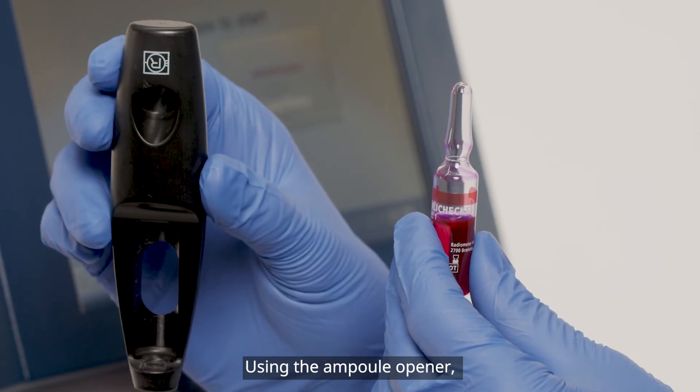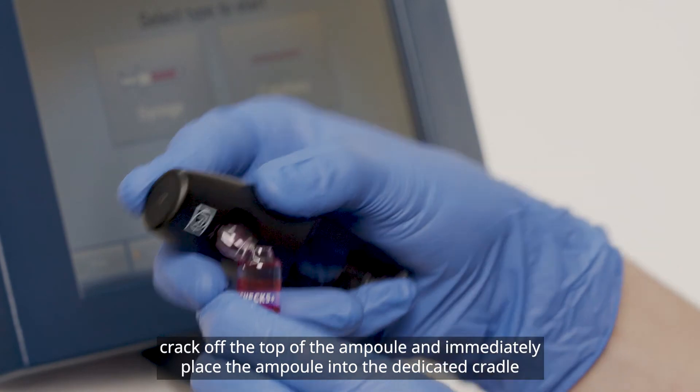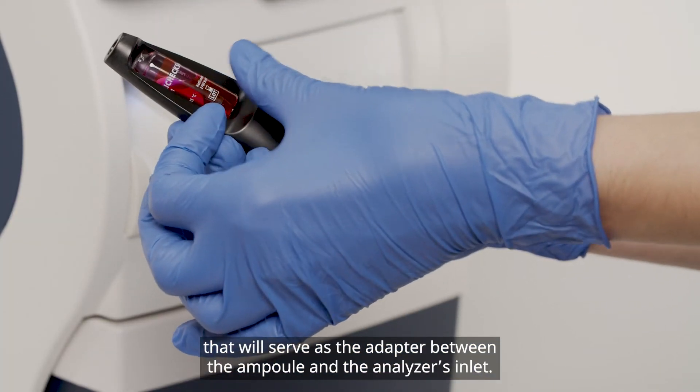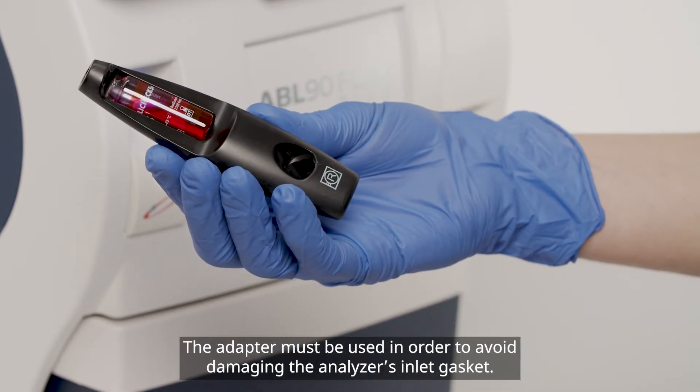Using the ampoule opener, crack off the top of the ampoule and immediately place the ampoule into the dedicated cradle that will serve as the adapter between the ampoule and the analyzer's inlet. The adapter must be used in order to avoid damaging the analyzer's inlet gasket.